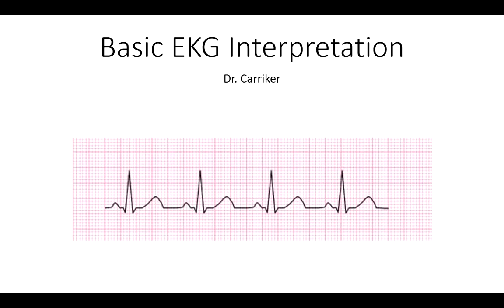So we'll begin with some basics and move forward and take a step-by-step approach in some regards, but please keep in mind that the material covered in this individual lecture is not likely enough to provide a high level or degree of competency for interpreting EKGs on a large scale. So the things that we'll cover will be of unique importance, but may not provide all of the tidbits and all of the criteria that a cardiologist, say, might be looking for on a given rhythm strip.